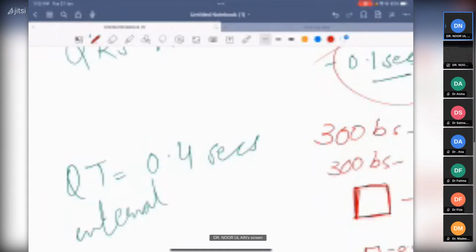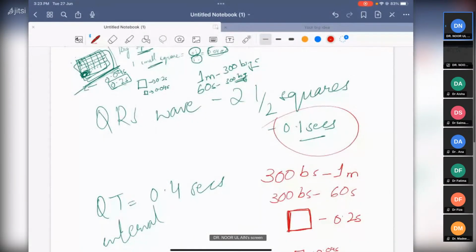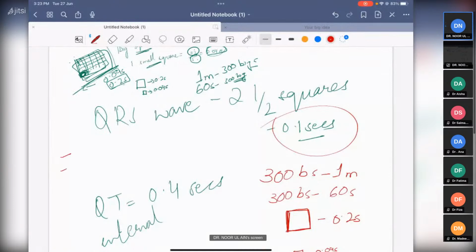Very good. Dr. Shazib, super smart. Yeah, remember. So I'll make one thing easy for you guys to remember. When you talk about an ECG, there are three things you should talk about. There is a wave, and there is a segment, and there is an interval. Okay? Waves are what? P, Q, R, S, T. Right? These are your waves.